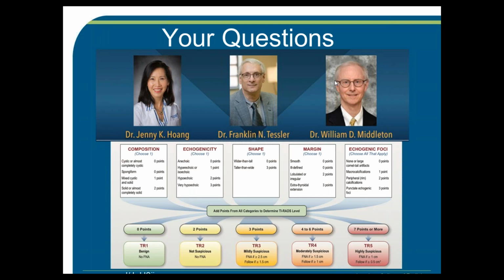In those cases, I follow the recommendations as outlined in the white paper and we've discussed today. I say specifically that no FNA or follow-up is recommended.